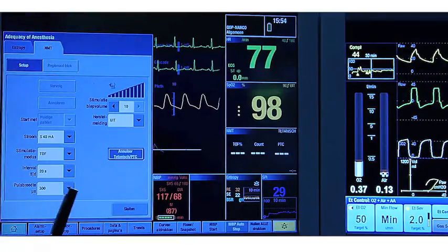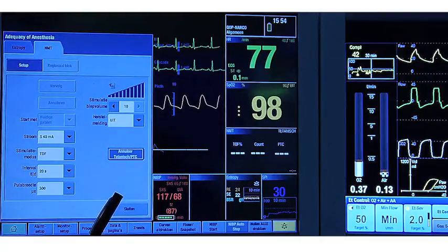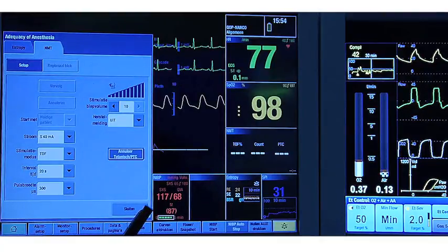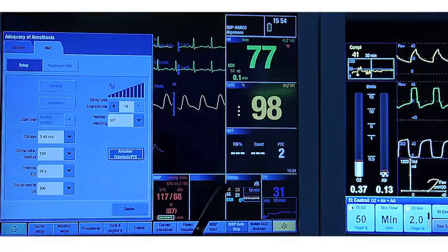it will be stimulating first train of four, tetanic stimulation, and now the PTC count is starting.